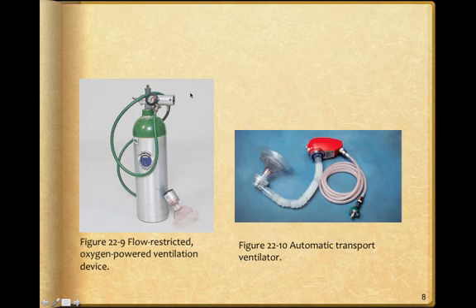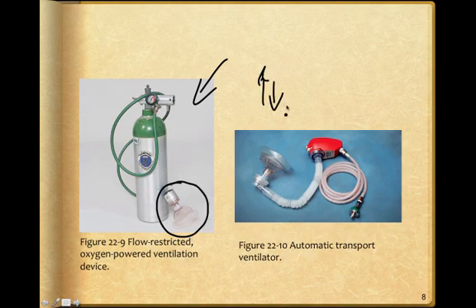This is a demand valve, our flow-restricted oxygen-powered ventilation device, and we've got to be careful with these. Please look at the rise and fall of the chest, because we can overventilate them very easily.